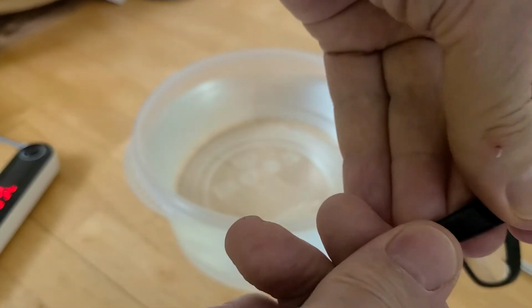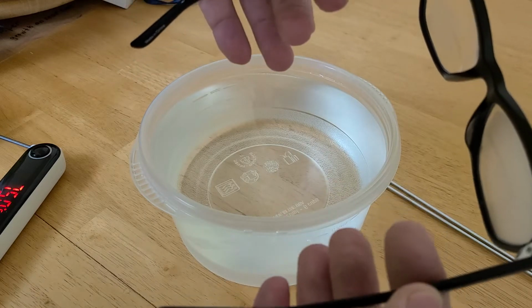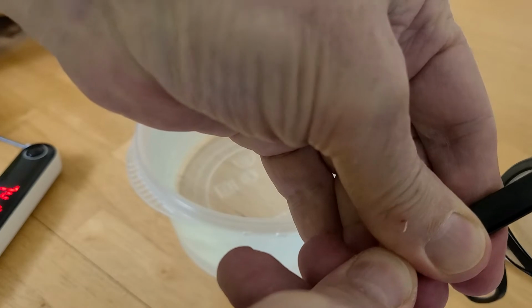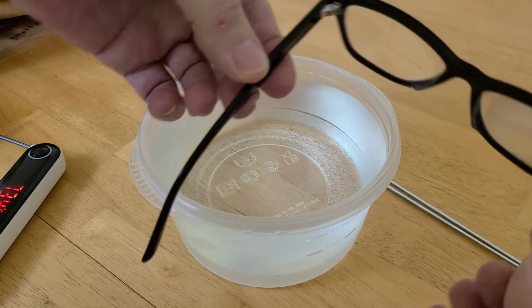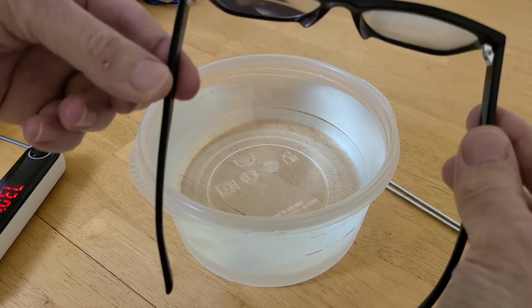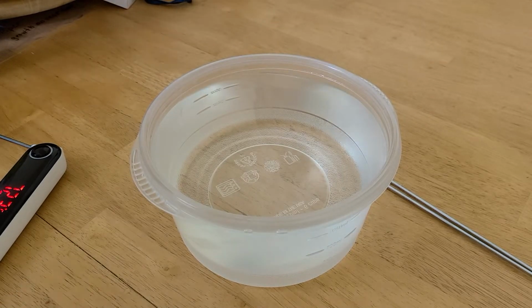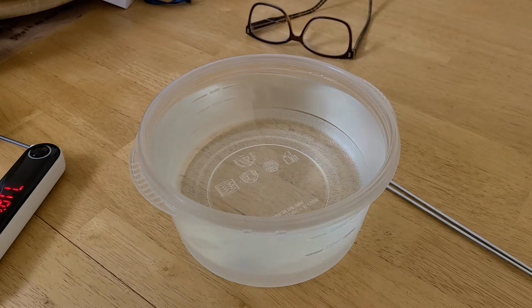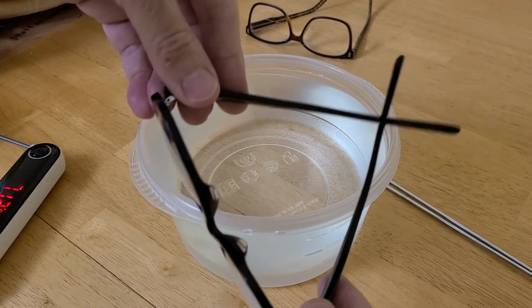I think it's working. Okay, so I think that they bent. I'm going to try them on. You're not going to see me trying them on, but okay. So they feel, I have a little bit looser fit now.